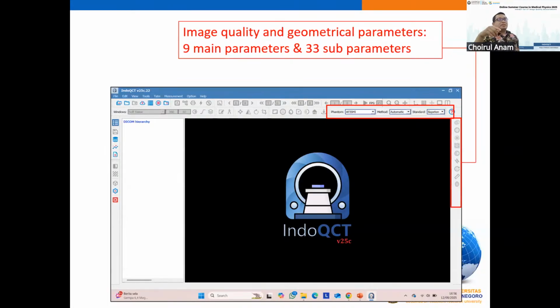For example, for measuring the noise, we can measure the noise level, the noise uniformity, NPS, and so on. For the spatial resolution, we can measure using visual observation. We can measure MTF, modulation transfer function, using the point object. We can measure the edge transfer function using the edge object. And we can measure the TTF, task transfer function. So the total is 33 sub-parameters.